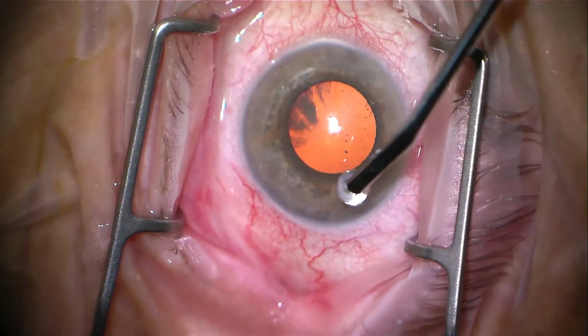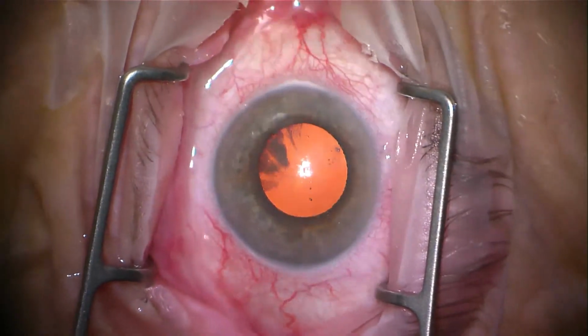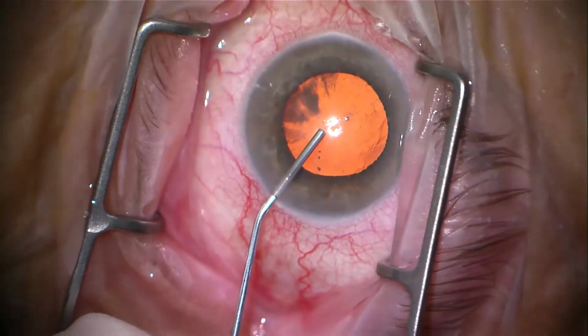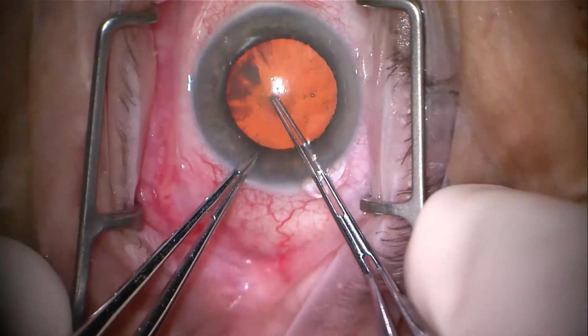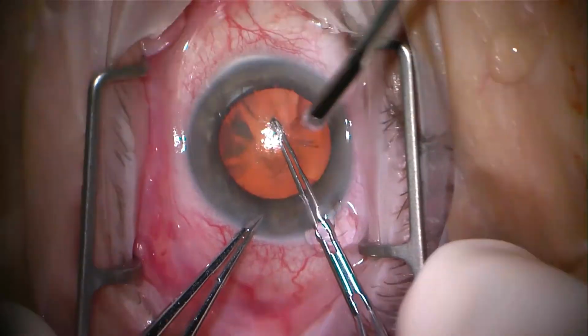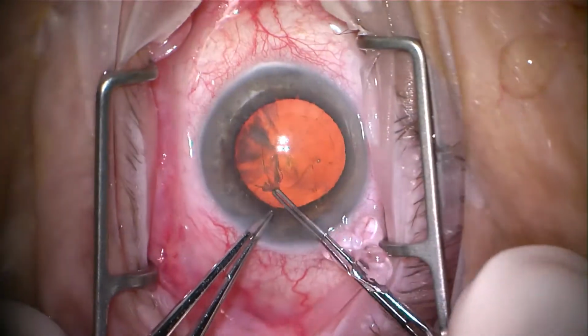Here in a few more seconds, we're going to go ahead and put in viscoelastic to achieve a bit more dilation and proceed with the case. So there's the viscoelastic. And then here in a higher speed mode, I'm going to go through the regular steps of the case. Here's the capsulorhexis.